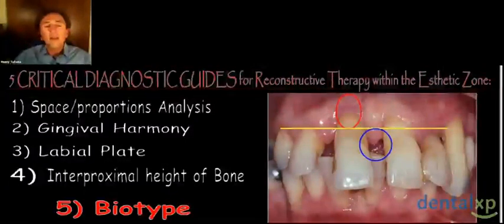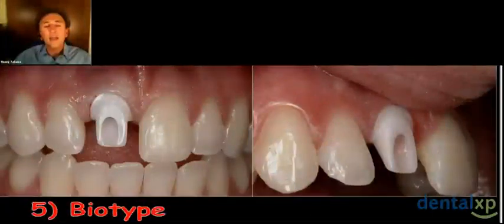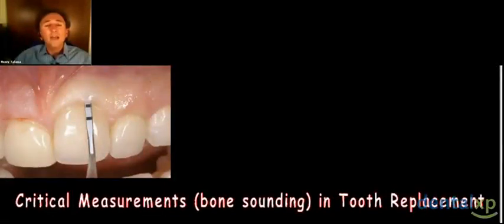Thin versus thick actually is much more important in implant dentistry to make that diagnosis than whether it's flat or scallop. Thin versus thick is the critical component that will affect our treatment plan and will affect our enhancement of that particular interface. When we have thin tissue, we may graft it, we'll use ceramic abutments, we'll change the subgingival contour of the abutment, as you'll see, most often reducing contour, creating a concave or flat emergence profile.